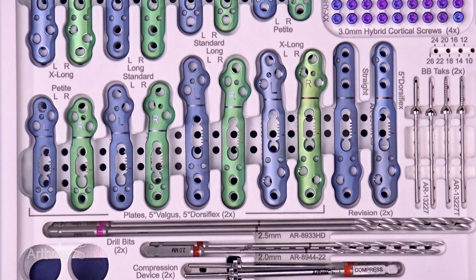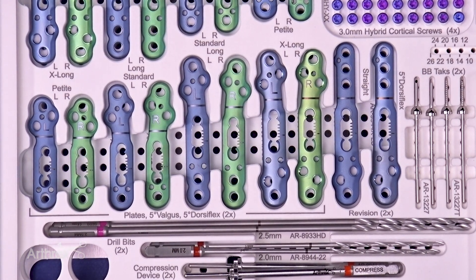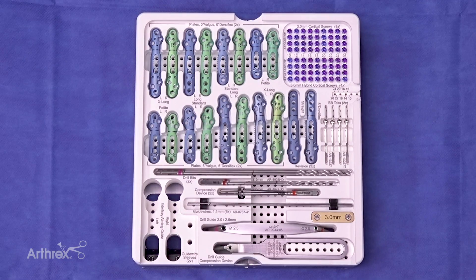Available in the MaxForce set are petite, standard, long, and extra long plates, in addition to a revision plating system. The plates are available in 0-degree valgus and 0-degree dorsiflexion, and also 5-degree valgus and 5-degree dorsiflexion, and each plate comes in right and left sided.